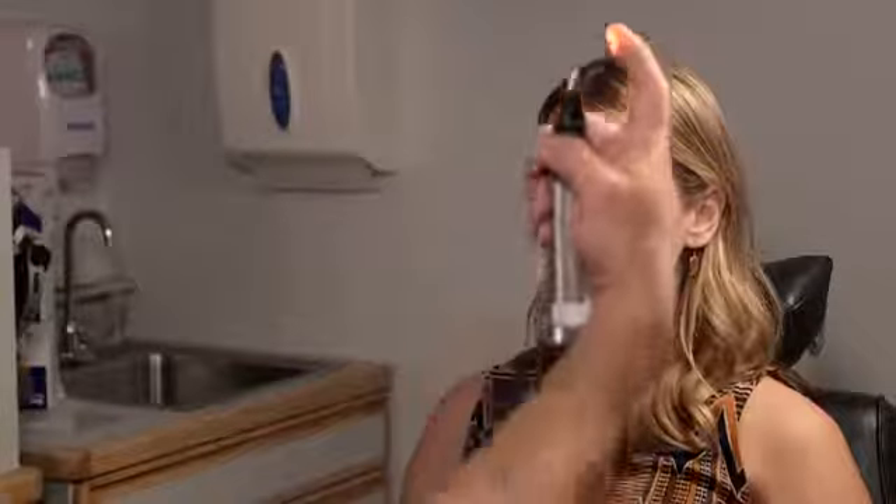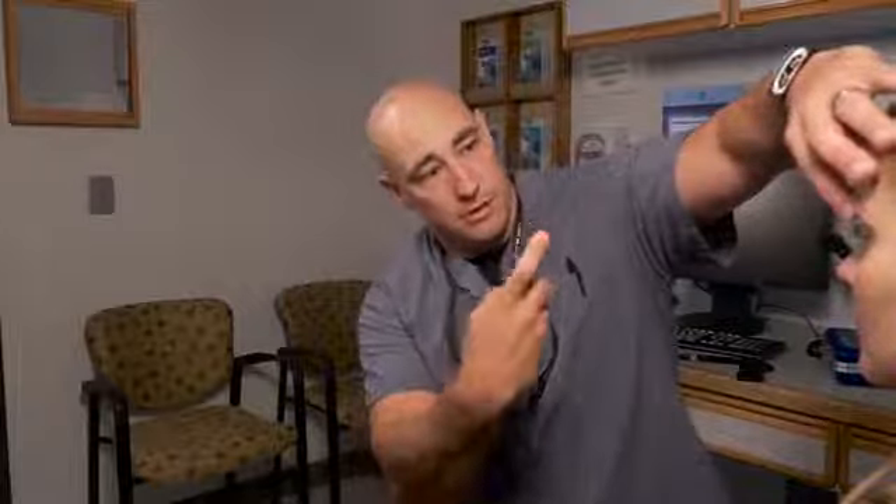Next we're going to check motility. I like to use a muscle light with my finger on it — it's just an easy target for both adults and children to follow. Keep your head very still and just with your eyes, follow my finger. We're checking all positions of gaze. I'm going to gently lift your eyelids up to make sure they can move their eyes all the way down — I'll hold the upper eyelids up to get a really good view.